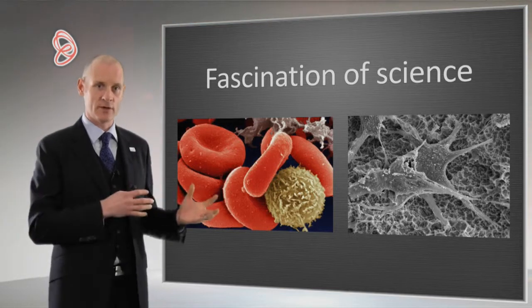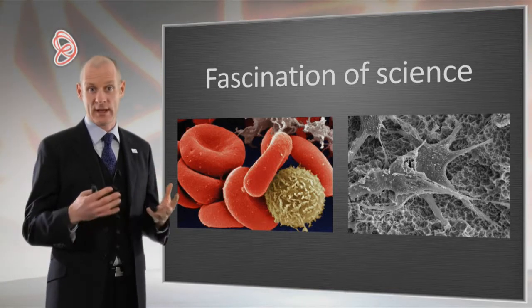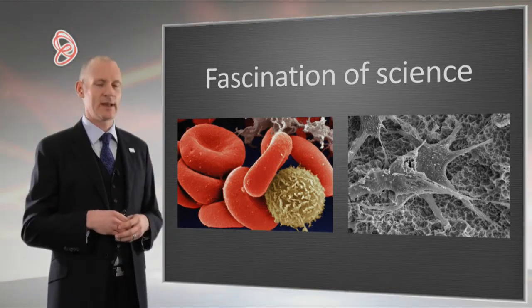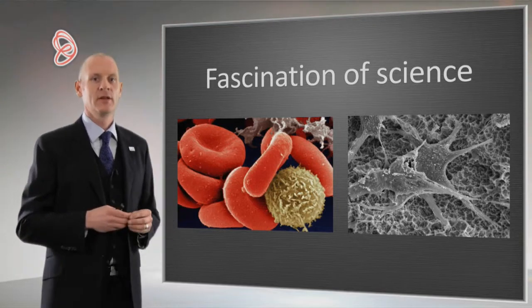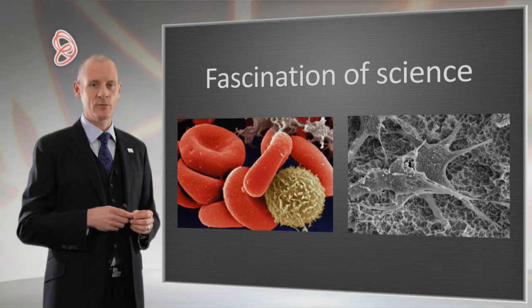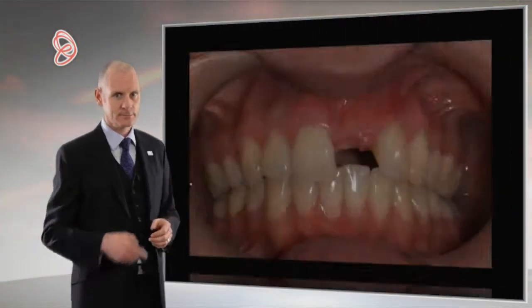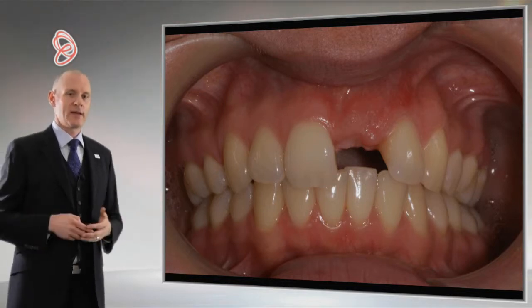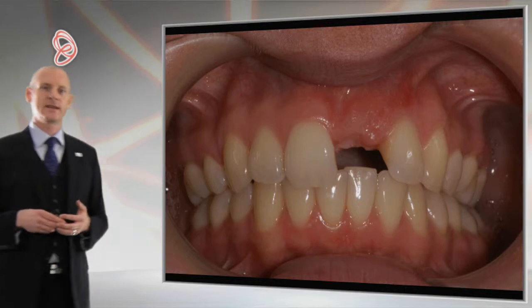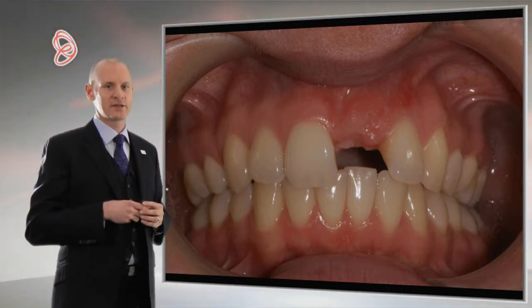It takes you out of your comfort zone and into an area that makes you think about materials, about adhesives, about cements, about design, about all sorts of things that you perhaps took for granted. And it links up, in my case, with the implant dentistry fantastically. We do implant dentistry to as high a level as we possibly can. In this case here, a missing upper left central incisor.